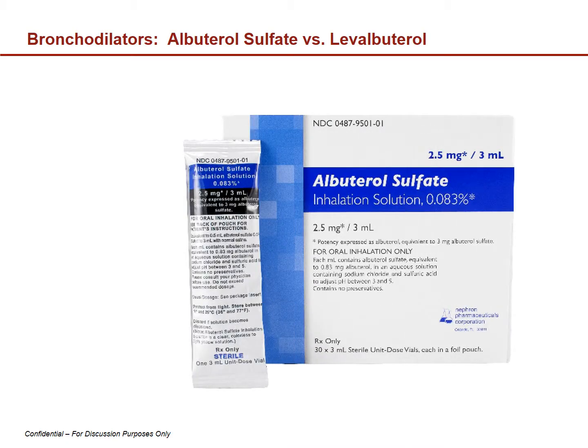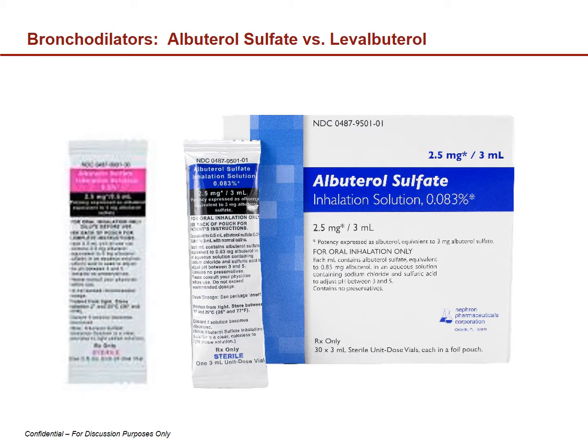Intermittent nebulizer therapy with albuterol can be used for patients with less acute bronchospasm resulting from small airway muscle constriction. Use the blue labeled unit doses to administer albuterol by itself. The pink labeled unit doses can be used for mixing albuterol with other medications like Atrovent or Pulmicort.